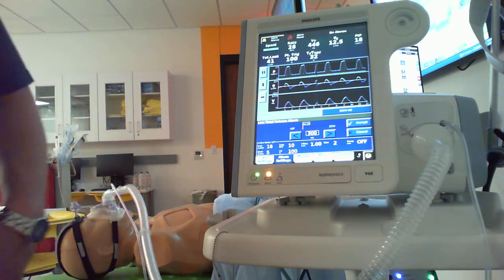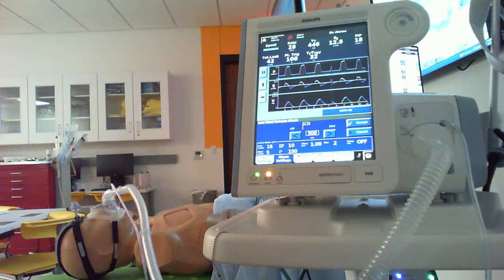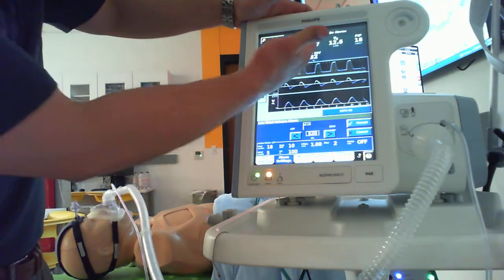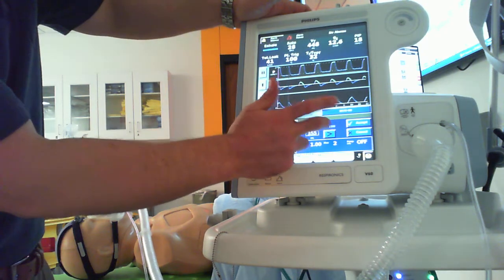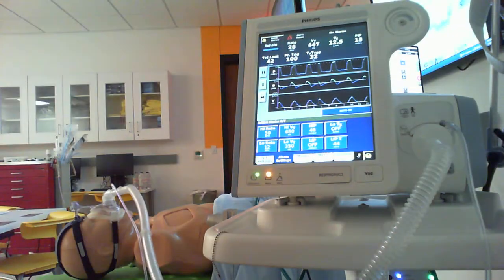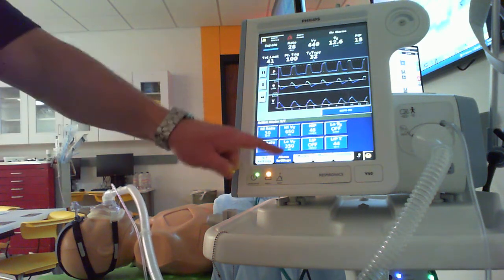So this guy's 70 kilos. If we did his 4 mil per kilo, that'd be 280. That's getting down there. So you can set this at 300. If you wanted to set it 100 beneath what your current target is, that'd be fine. I'm going to set it 100 beneath right there, okay? I want to make sure I keep this guy doing good and keep him from getting intubated. All right, so high and low.